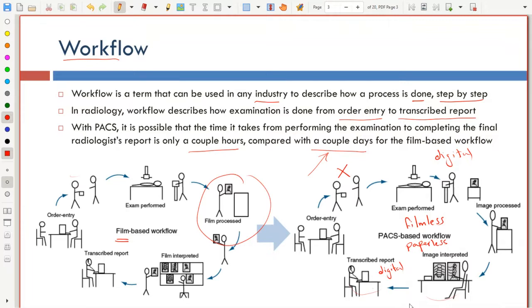If your system will make the workflow easier, smoother, faster, then your software will be very much welcomed. If it requires some additional training, if it requires some additional delays for people to adapt, or might be confusing such that it might actually not be as efficient or as fast as it's supposed to be, then it would be rejected by everyone.